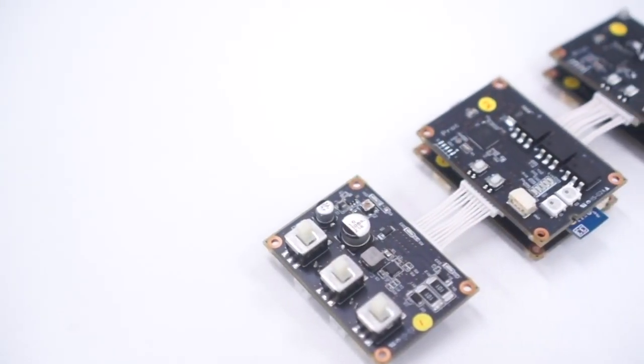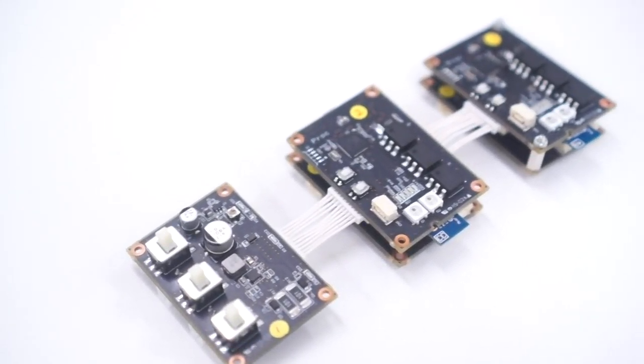We developed a scalable and multiple muscle I.O. system by means of biosignal measurement and electrical muscle stimulation.